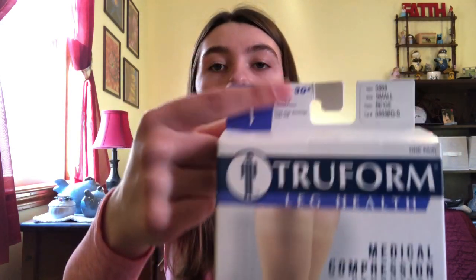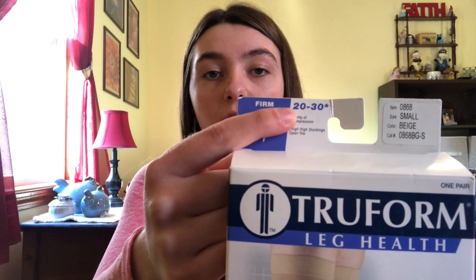These are the compression stockings that I wear. These are called True Form and this is the range that I get — 20 to 30 — because that's what was recommended to me by my doctor. I also opt for the toeless ones, as you can see here. They do make different kinds. I used to get the ones with toes but I found them to be kind of hot in the summertime. So I always get these ones, and without further ado, let me show you guys how to put them on.